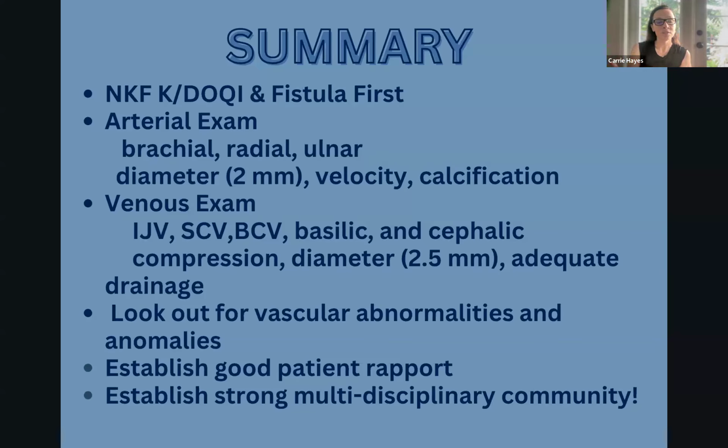So looking out for these vascular abnormalities and anomalies, establishing a good rapport with the patient, because you're probably going to see this patient again if you're mapping them.